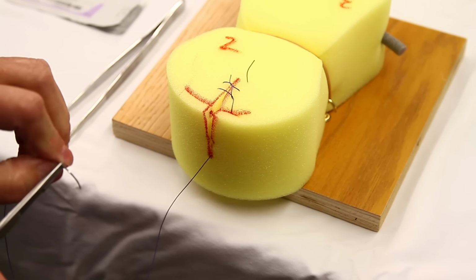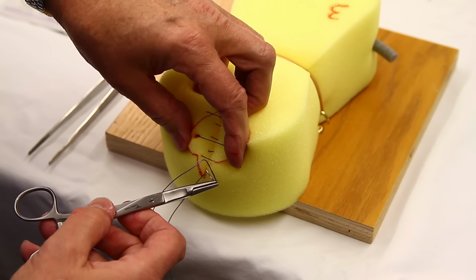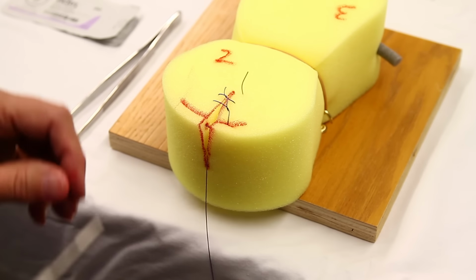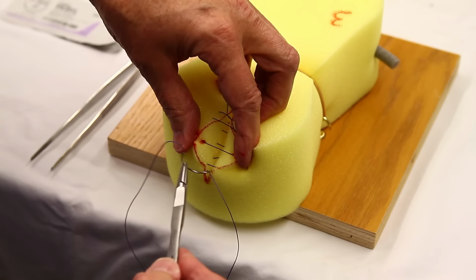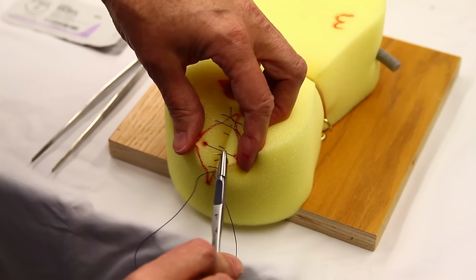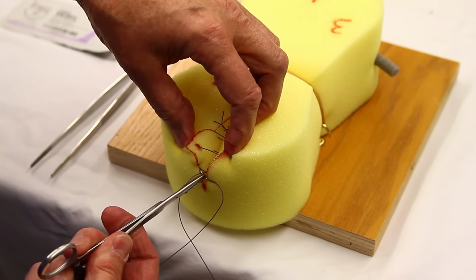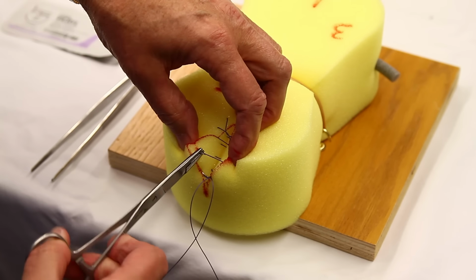You can grasp the needle in a shorter arc for these and go straight across and upward. This will pull the edges of the skin together nicely. So these are zigzagging their way upward. You notice I have to grasp the needle in alternate ways on this part. And stay close to the skin, or a millimeter or two under the skin.